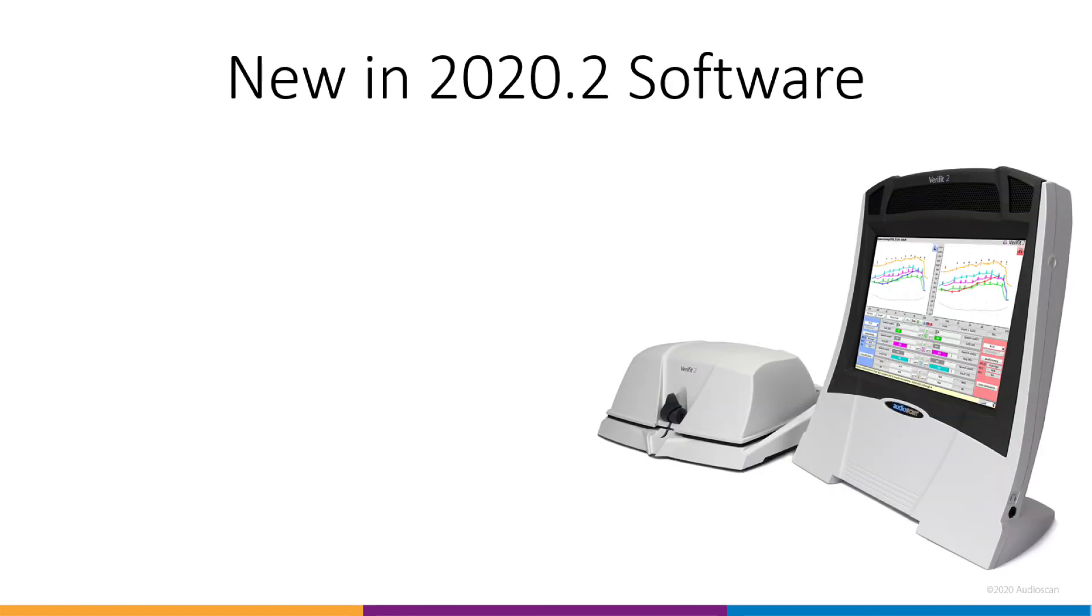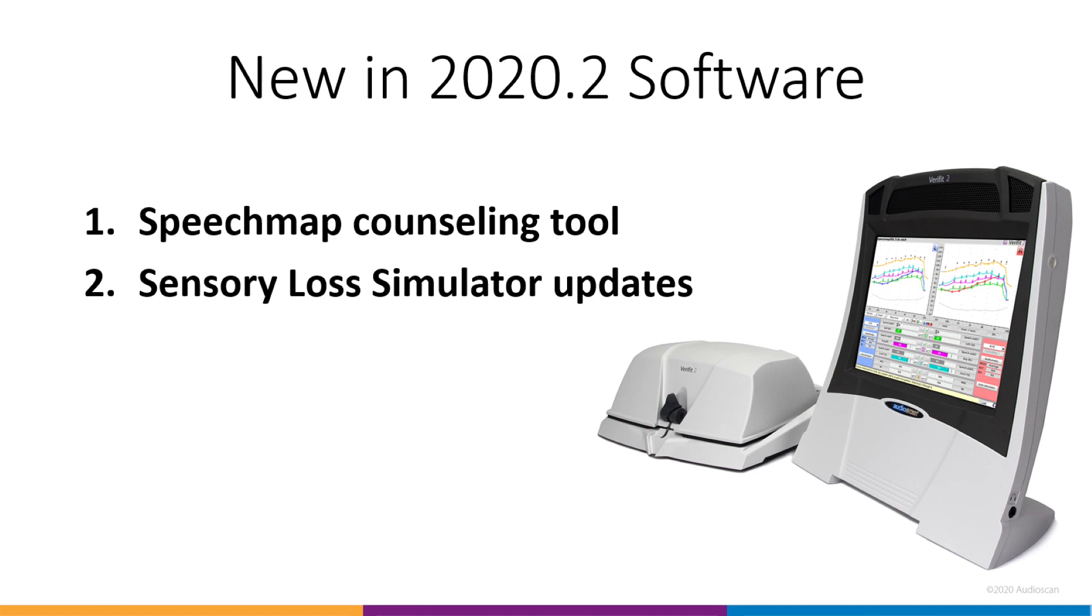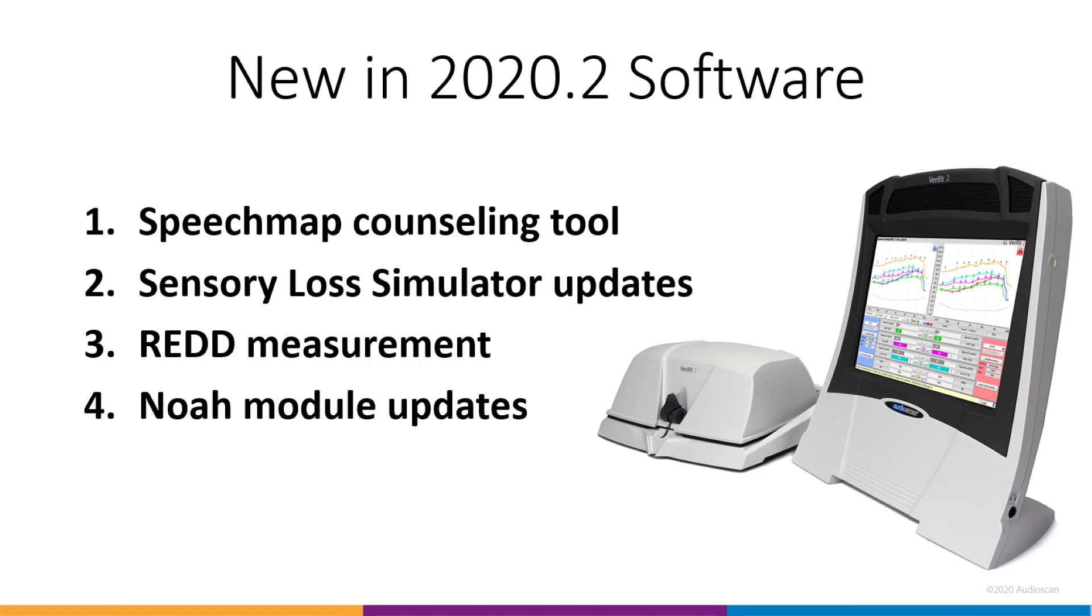First, we have our new SpeechMap counseling tool. Second, some updates to the Sensory Loss Simulator. We've added real-ear-to-dial difference measurements to the Verifit 2. And finally, a couple of updates to the Noah module.